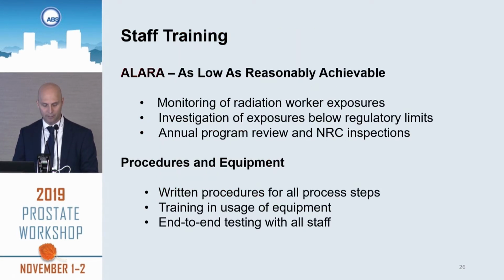Staff training in radiation and handling is also managed by physics staff during commissioning. So if you have an independent radiation safety team, this would be the time to engage them in the process and discuss the distribution of responsibilities. The staff will need to be monitored for radiation exposure. That's the first bullet point here. And you should have procedures for handling high readings, or how you'll annually review what the badge readings were.